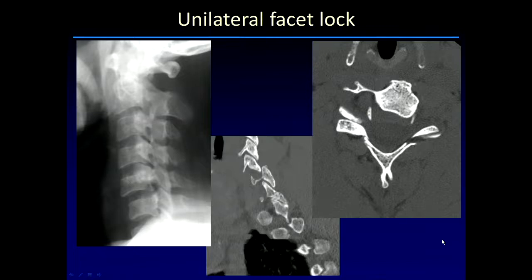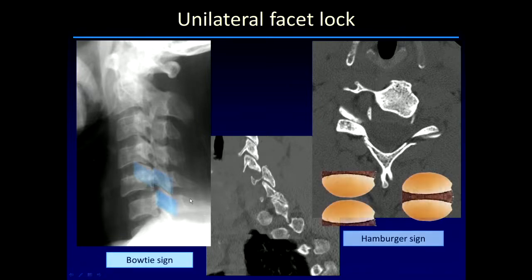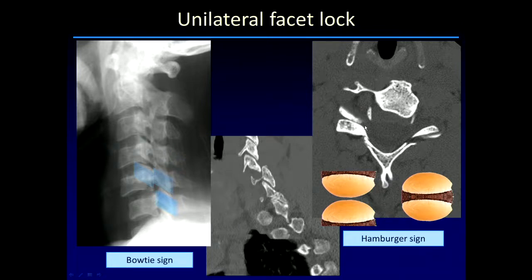If the flexion injury is combined with rotation, the lock may be unilateral. In these patients, the degree of listhesis tends to be less pronounced and can be difficult to appreciate on radiographs. On a parasagittal CT on the side of the lock, you can see the abnormal relationship. On the axial images at the level of the lock, the abnormal side shows the so-called reverse hamburger sign, where the rounded non-articular portions are in contact with each other rather than the normal flat articular portions.